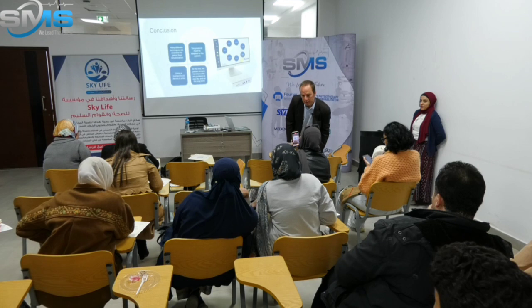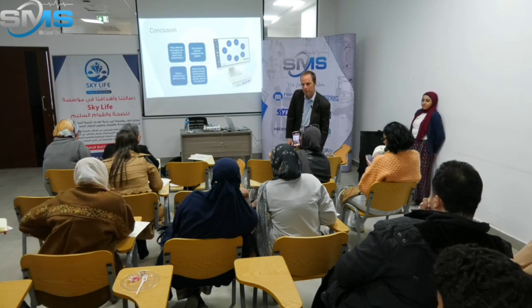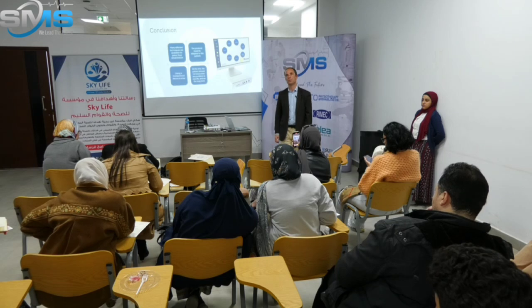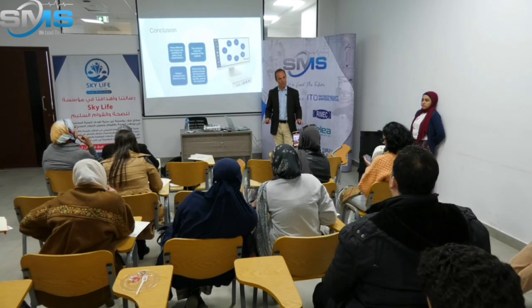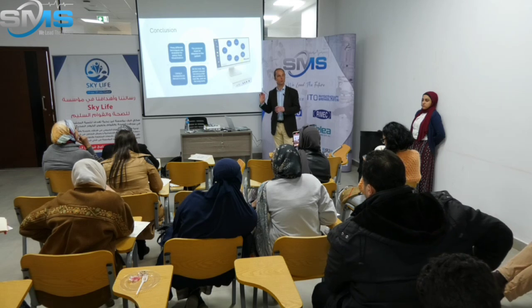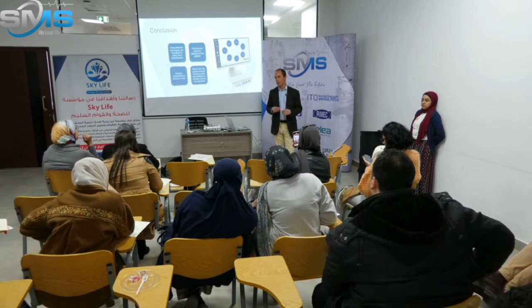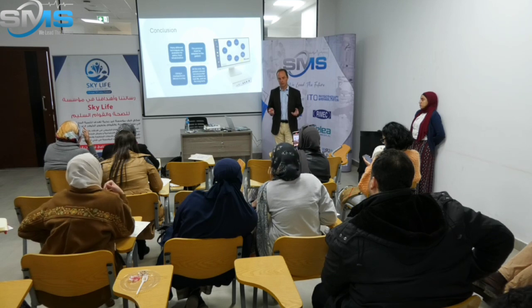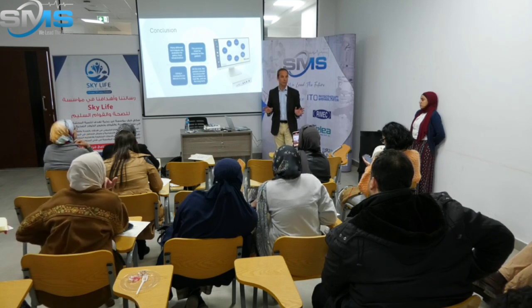Is it normal to have pain during the test? Usually there is no pain at all. If there's pain, you stop, you treat the pain, and later on you can work. If your patient is in pain, she won't listen to what you tell her, she will just think about her pain, and it won't be efficient.